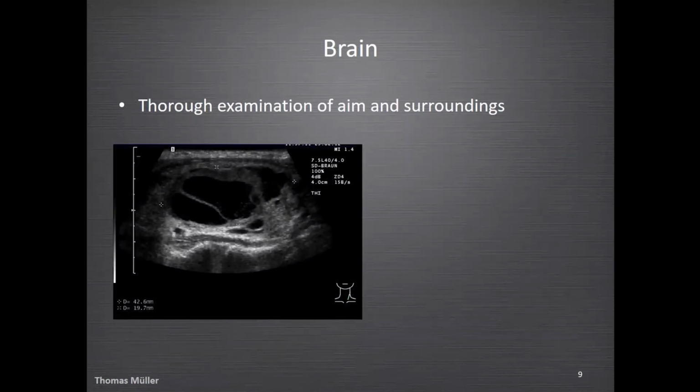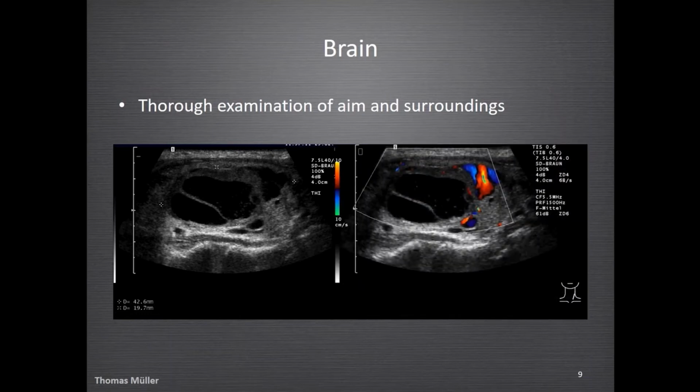And what is around? If, for example, we have a cystic lesion of the neck, and puncture seems to be easy, but be careful. Maybe you put on color Doppler in advance and you realize that that cystic lesion on the right side of the image is a large vessel. You would better not puncture. So what is the safe access? It's from the left side of the image here.